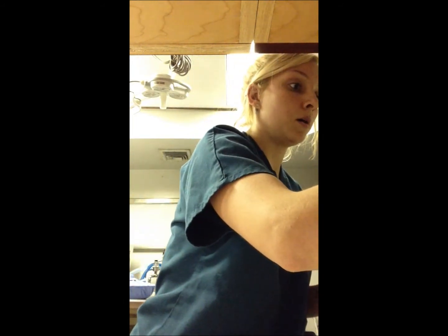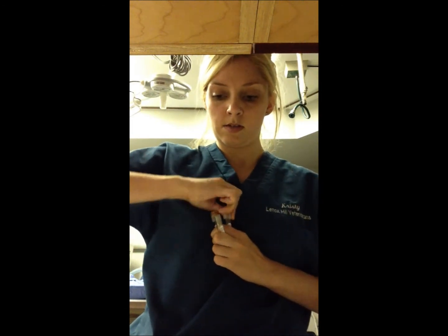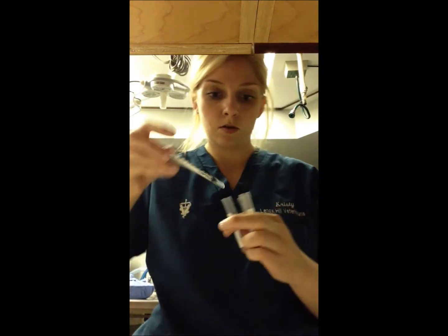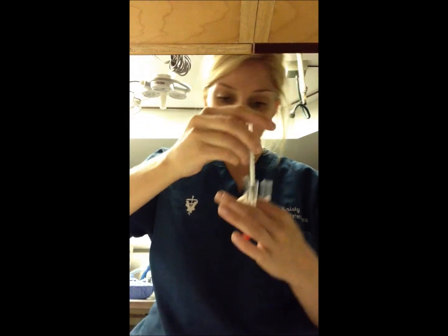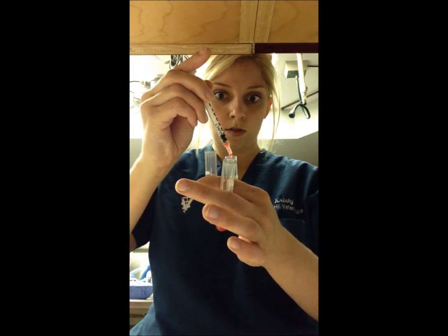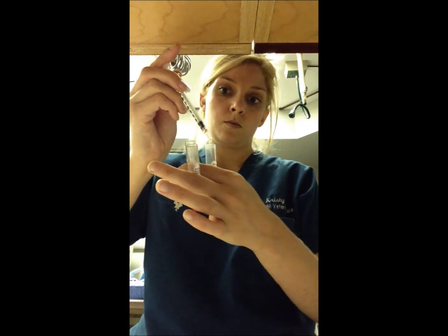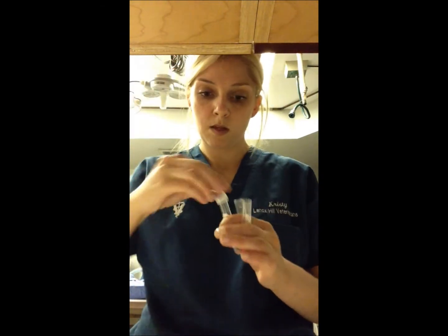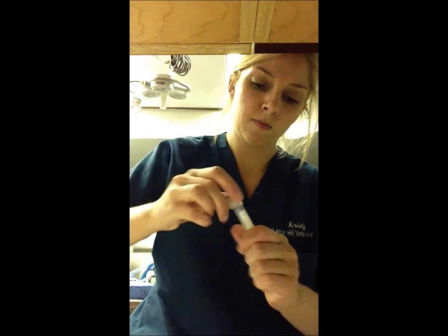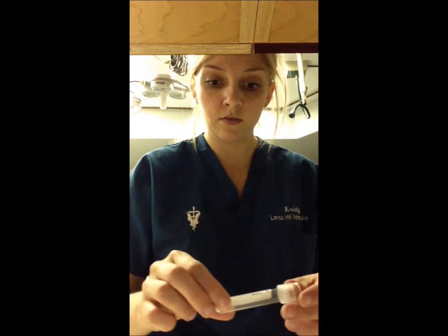So for Ruby, you're going to go ahead and mix her serum with her erythrocyte suspension. You're going to put 2 drops of each into the vials. So this is her erythrocyte suspension. One drop, 2 drops. You get another syringe for the serum. One drop, 2 drops. Put the caps back on all of them. Okay, shake it a little bit, and this is Ruby's control, and you're going to go ahead and do the same thing for Ethel.